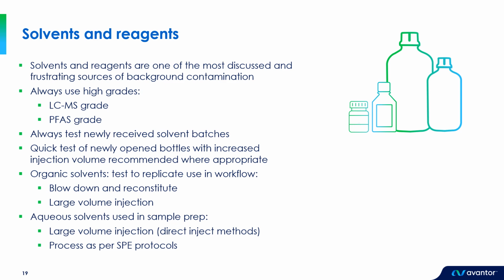Testing aqueous solvents and buffers is a bit more involved since they're typically used in the sample prep procedure. There may be some possibility to do large volume injections, potentially up to a milliliter, and I've seen direct inject methods where analysts use such injection volumes. But another option, of course, is to process those aqueous solvents as per the PFAS analysis protocols. And in methods such as the EPA methods, that's typically covered by our solvent reagent blanks.